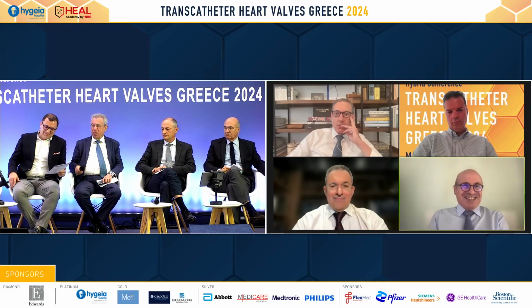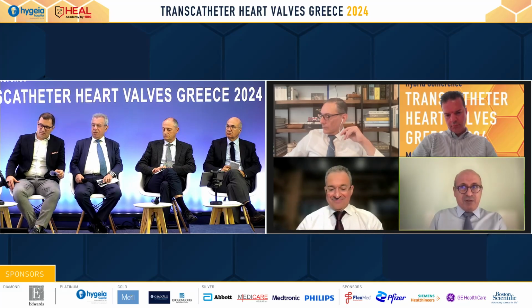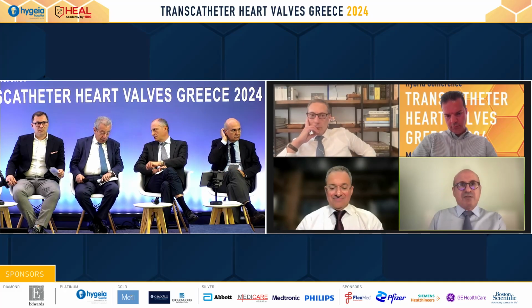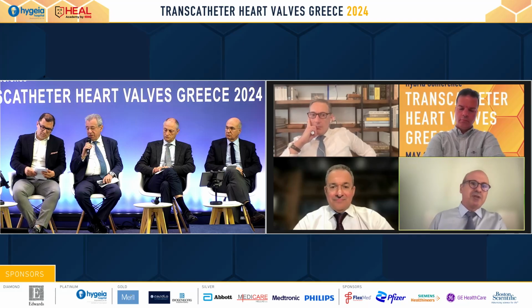I would say none, but if everything else is exhausted, then you should have a very good pre-analysis, CT scan screening, and satisfy yourself that the sizing is okay for the valve you're going to use. Satisfy yourself that the calcium is distributed in a symmetric way. Try to predict that your valve, when it expands, will go where you want it to go. And finally, make sure you're not going to have LVOT obstruction. So if you apply all this, very, very few candidates will be good for valve in MAC as we're doing today.